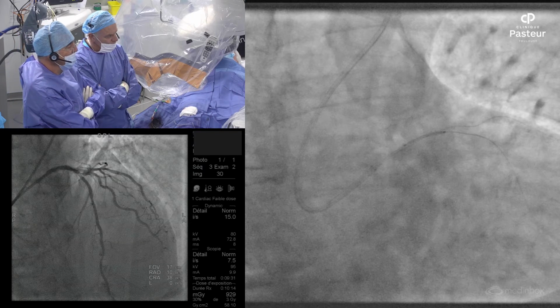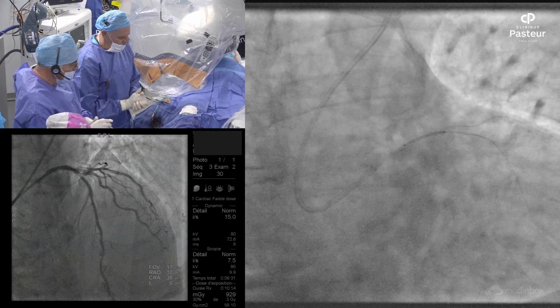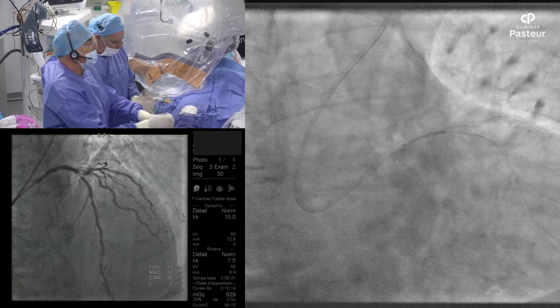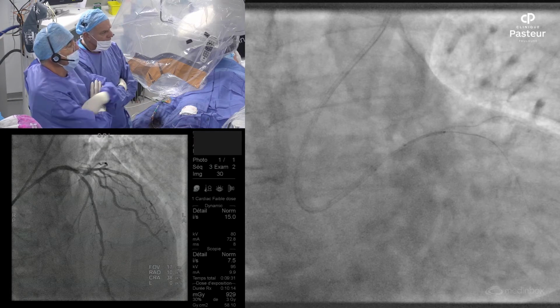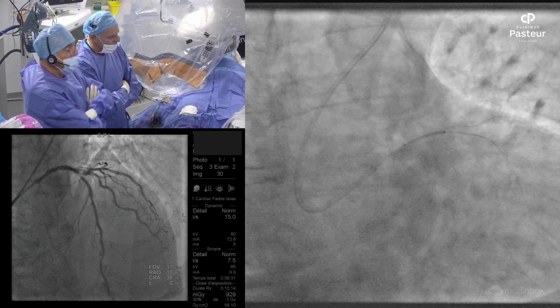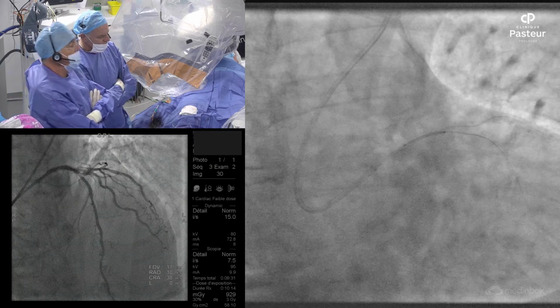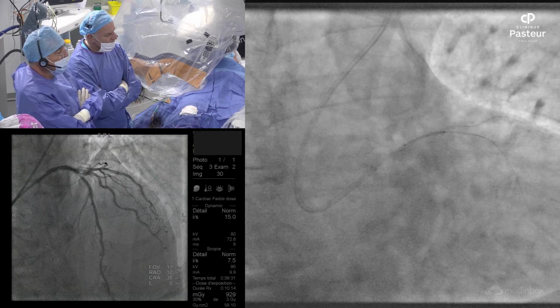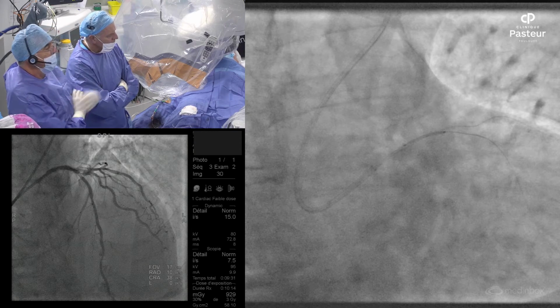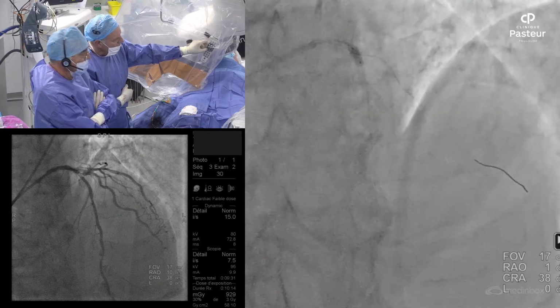In case of a very short, undilatable lesion, sometimes we use a very high pressure balloon, OPN balloon, and you can go up to 35, 40 atmosphere. This is for short lesion. If this is not working for short lesion, there is certainly an indication for lithotripsy. And it's true that intravascular lithotripsy using the shockwave balloon can help you to open a discrete heavy calcified lesion.